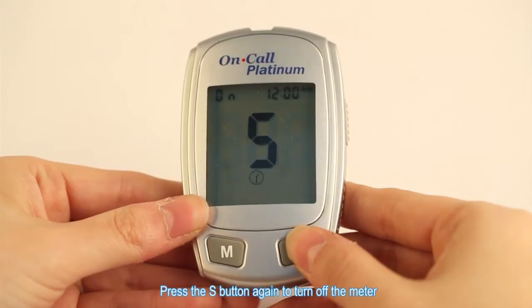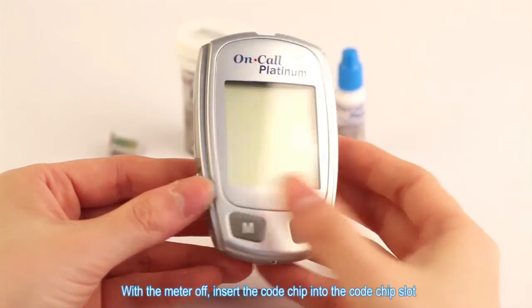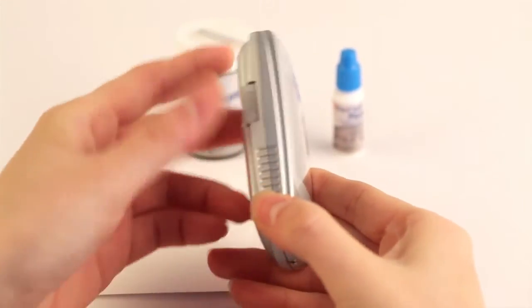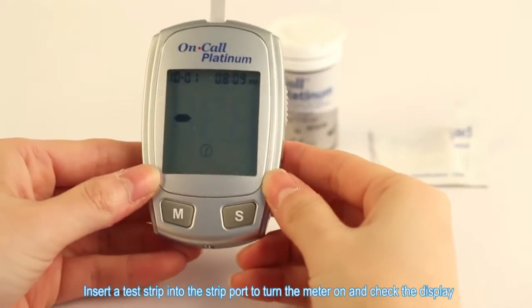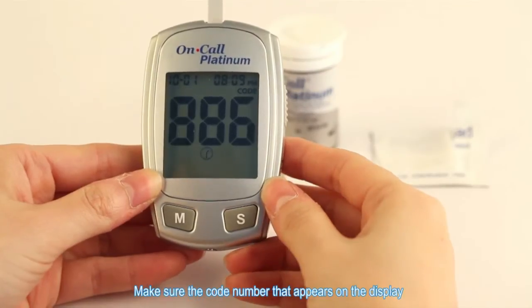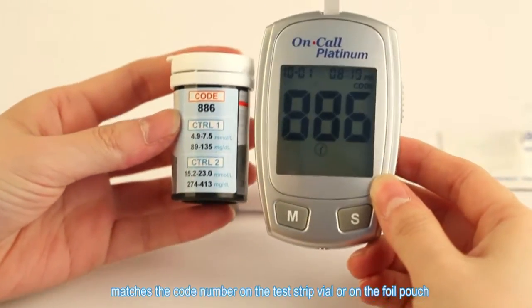Press the S button again to turn off the meter. Performing a quality control test. With the meter off, insert the code chip into the code chip slot. Insert a test strip into the strip port to turn the meter on and check the display. Make sure the code number on the display matches the code number on the test strip vial or on the foil pouch.